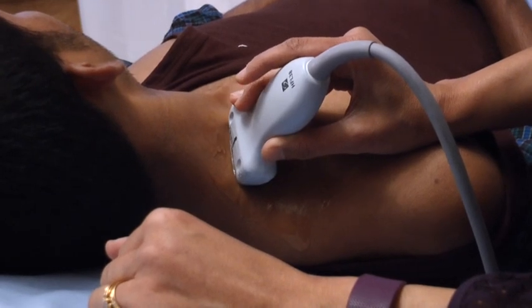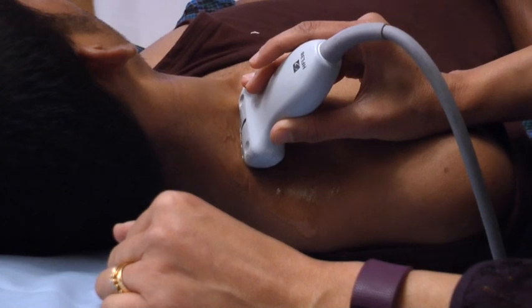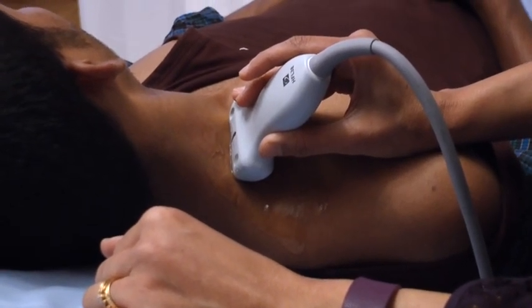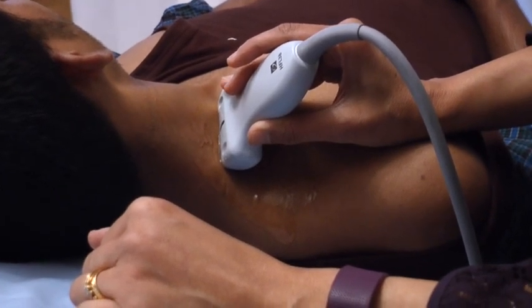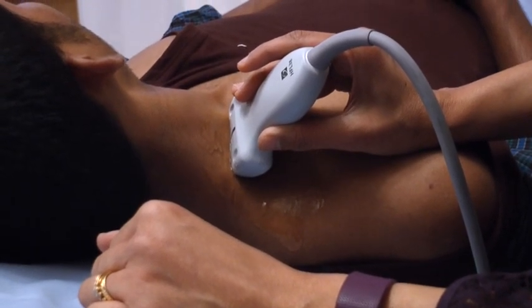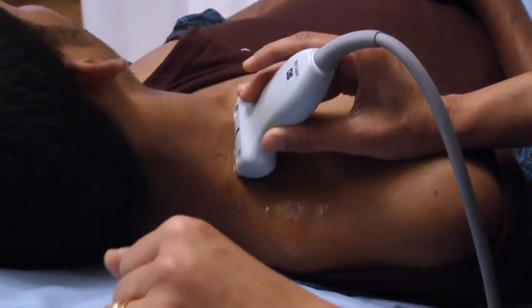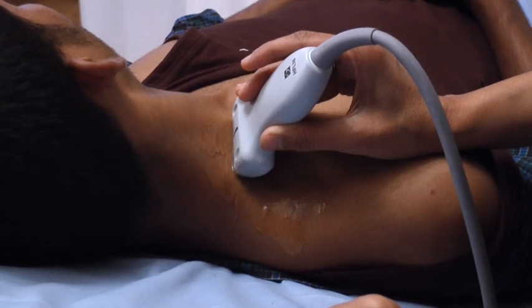Okay. So again, in-plane approach to the brachial plexus. You can come at the top of the C5 nerve root underneath the fascia and inject your local anesthetic over there. Make sure you've got enough spread on both sides of your plexus. And sometimes you can inject local anesthetic in between the nerve roots as well. But again, you've got to be careful not to do an intravascular injection in this area.